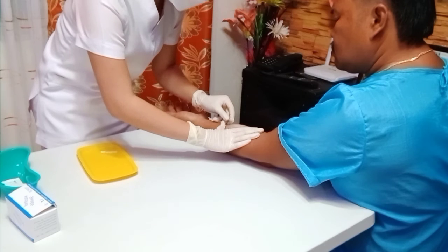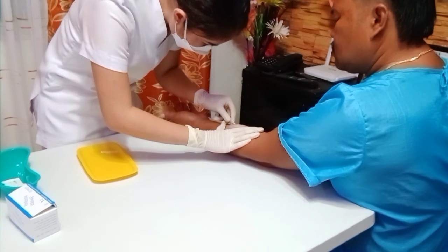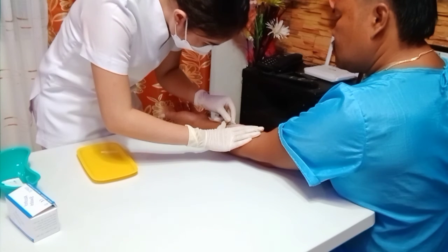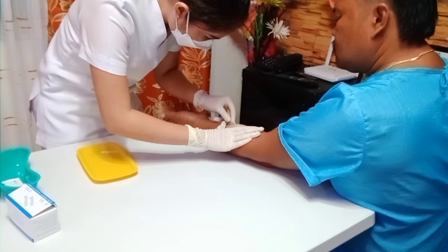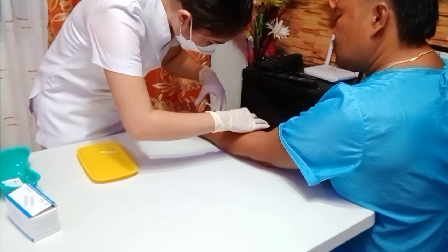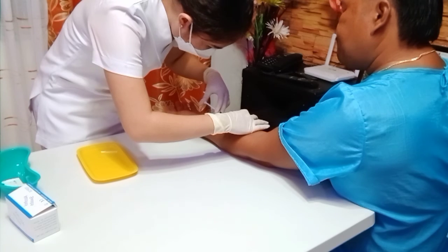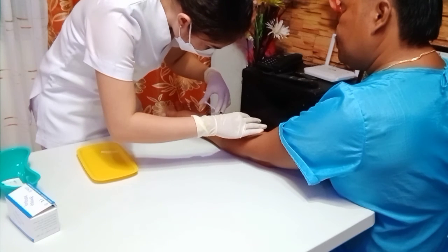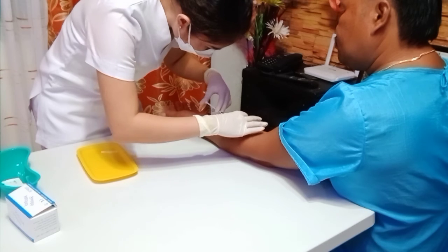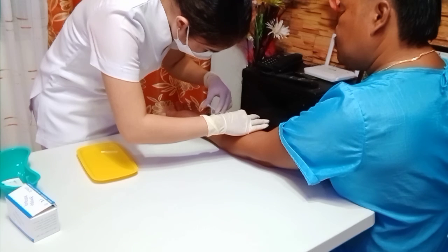Next is to insert the needle far enough until the bevel is through the epidermis into the dermis. This facilitates effectiveness. Next is to stabilize the syringe and the needle and inject the medication slowly and carefully. Rapid injection can cause speed shock.